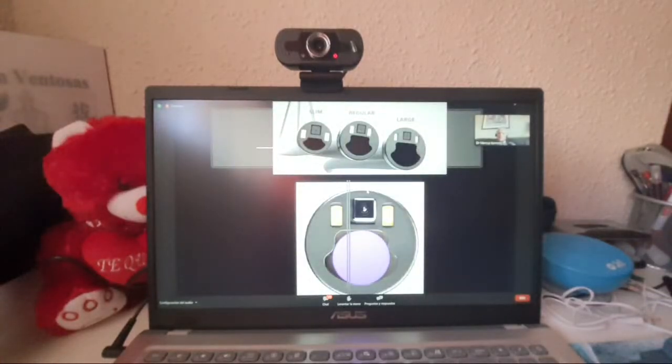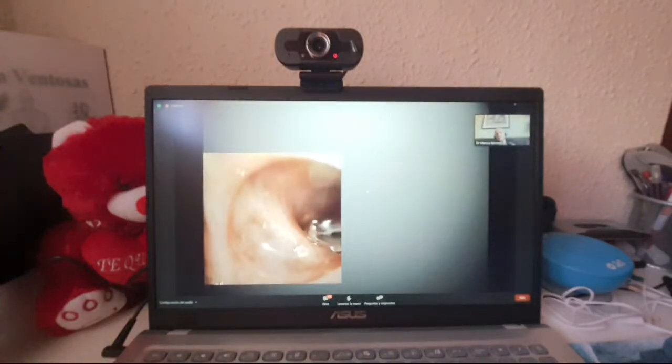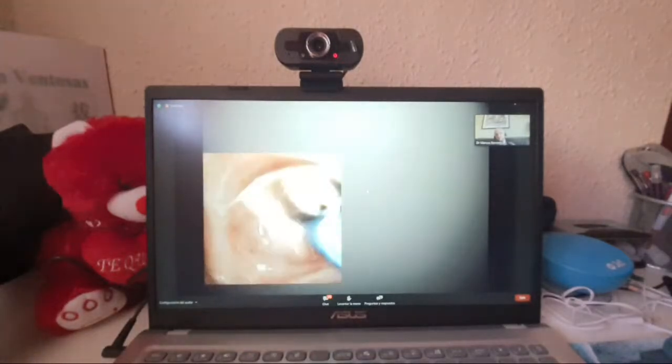So the reason for this is the way the Boston Scientific scope is designed. It's got, as you can see, grooves along the rounded channel, which allows suction around the device, but also there's a better proximal channel in the scope handle to get through to your suction. So for me, this is very important for what I do.